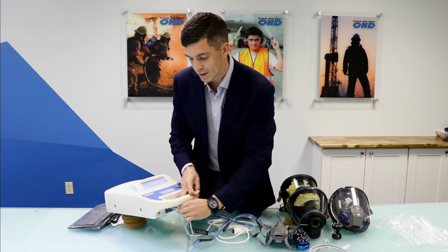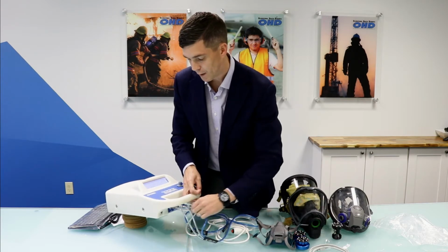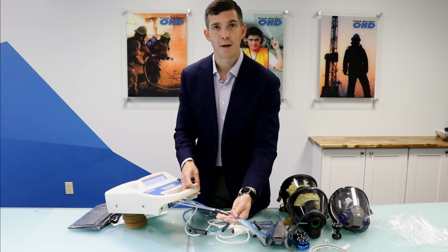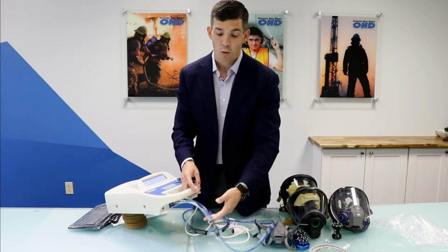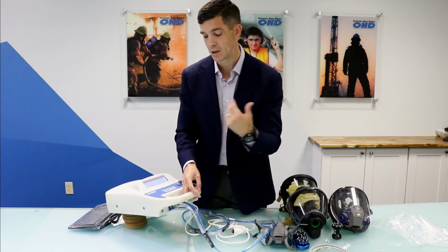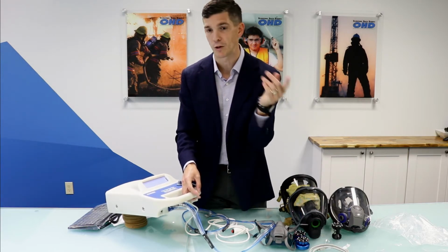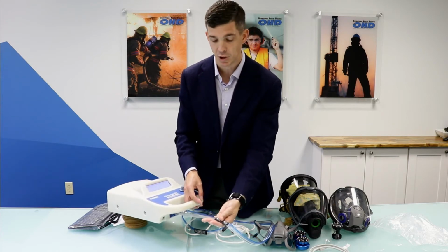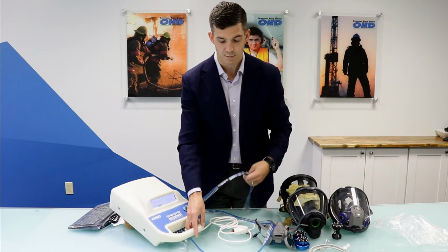So the way that I like to do it is I just connect these up. Once I get my flow tube connected, I make sure that they're flat across. What's key here is you don't want to see any crossing over of tubes. And when you're doing your testing, you just don't want to try to plug things where it looks like you're pulling them across each other. They're designed so they should be very flat and flush, and everything up front is tidy and looks good.